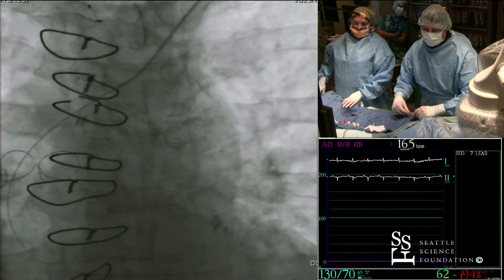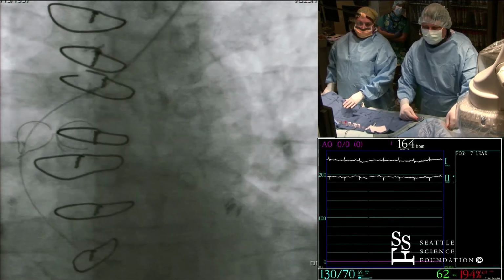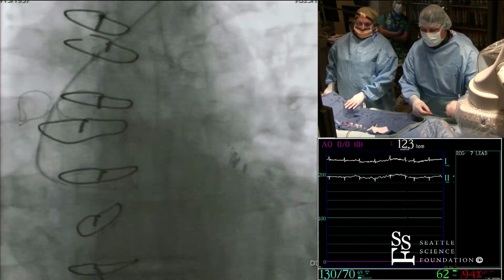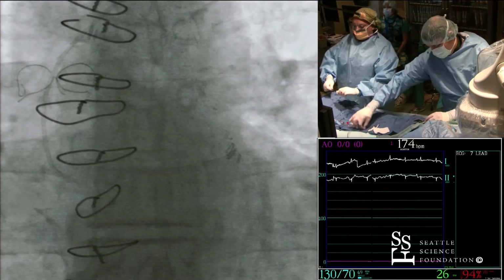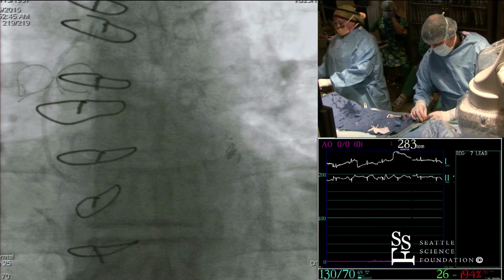There we go. So he's kind of got a horizontal arch there. This would be a very difficult case actually to do from the right wrist. You can end up with a Z shape of your catheters and make it a little bit more difficult.